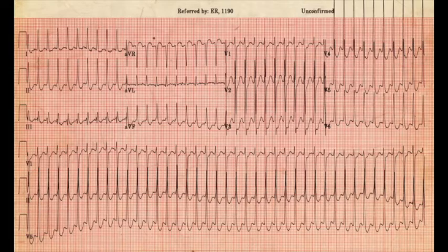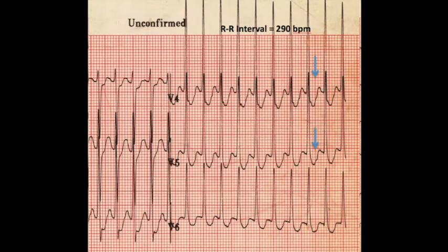One way to differentiate these two rhythms is to realize that orthodromic tachycardia often has rates that are in excess of 200 beats per minute and may be associated with ST segment depressions of greater than 2 millimeters or T-wave inversion in more than one lead. These findings are related to the rhythm itself and do not indicate myocardial ischemia.